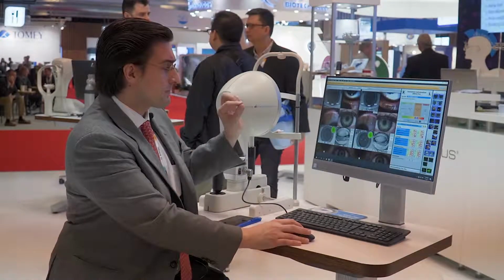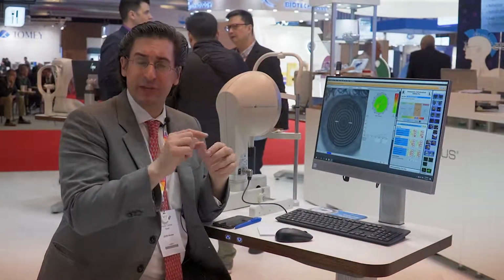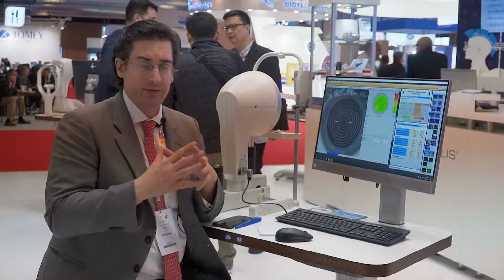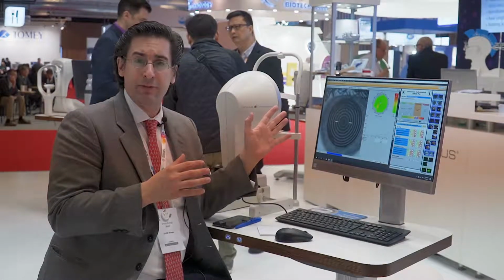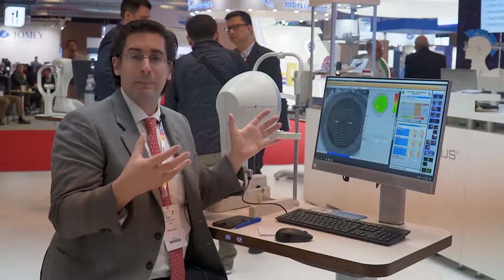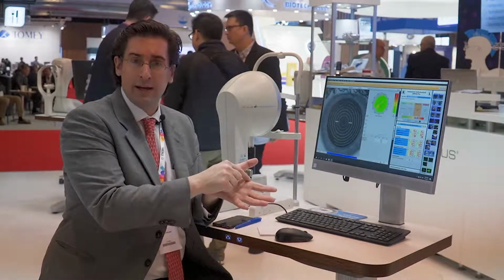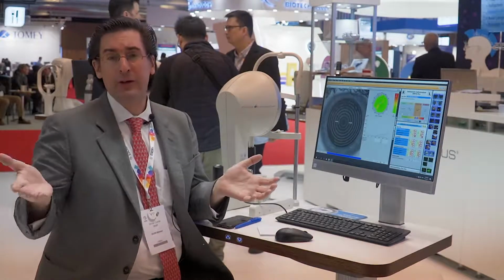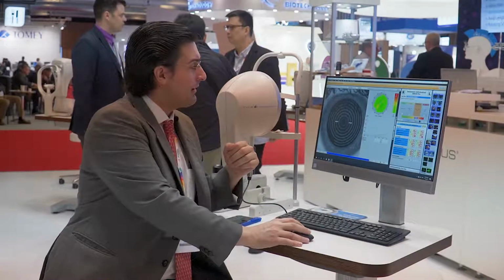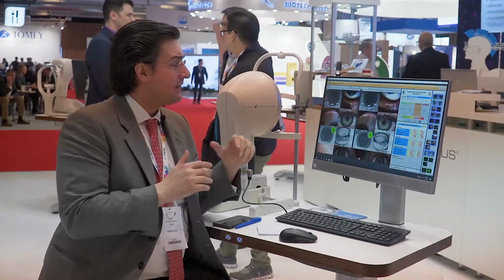Another very important picture here is the NIBUT. When we put fluorescein in the patient and try to see the breakup time, sometimes it can be subjective. And when you use Keratograph 5M, it's going to transform the subjective into a picture. And this we can show the patient and say, see, you have dry eye. And after the treatment, you can show the difference and say, see, you have improved.